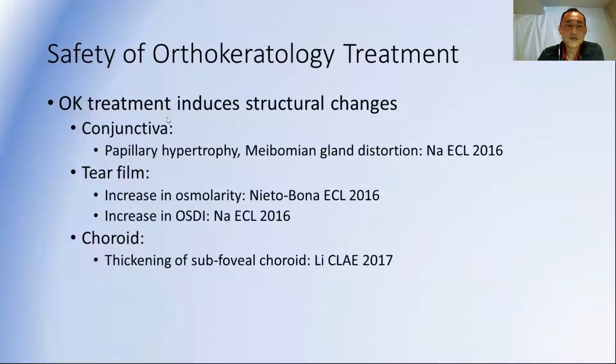In terms of conjunctiva, we sometimes see papillary hypertrophy like you do with any contact lens wear. This is going to happen more with lenses that are irritating the tarsal conjunctiva with poor edge design or high edge lift designs. Typically with Ortho-K designs, we don't see a lot of high edge lift designs. We're typically low edge lift, so that's usually not an issue. If the patient is not taking care of the lenses properly, or they tend to have a lot of protein deposition, we might see more of that, so that's something we'll have to keep an eye on and maybe manage with better cleaning regimens or more frequent lens replacement.